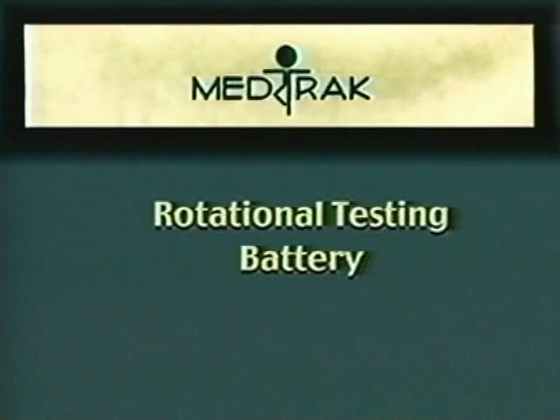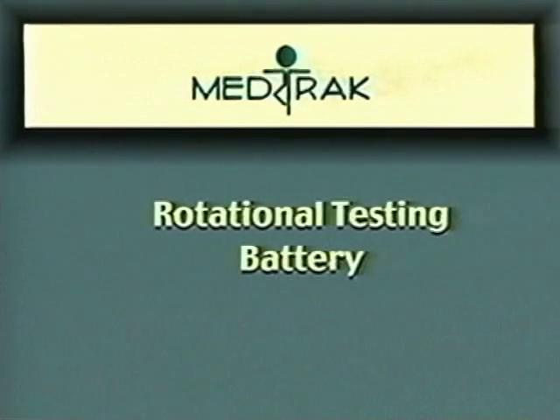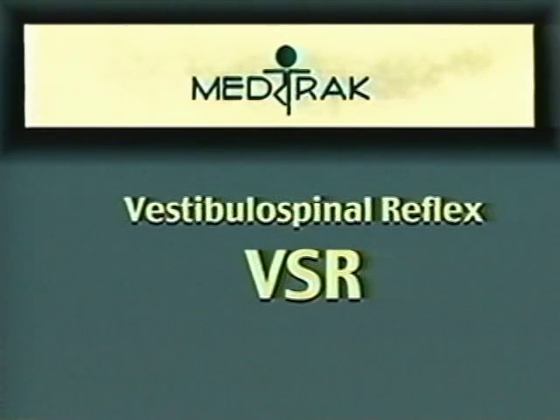The next section of analysis of the infrared VNG is that of the rotational testing battery. Active head rotation, or AHR, is performed at head speeds of 1 to 3 hertz for both the vertical and horizontal vestibular ocular reflex, or VOR. There is also testing that involves the cervical ocular reflex, or COR, as well as the vestibulospinal reflex, or VSR.